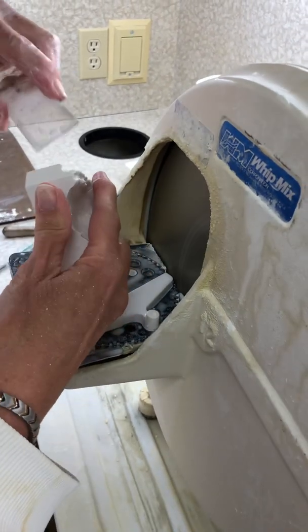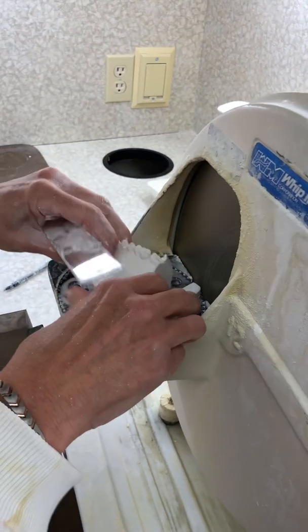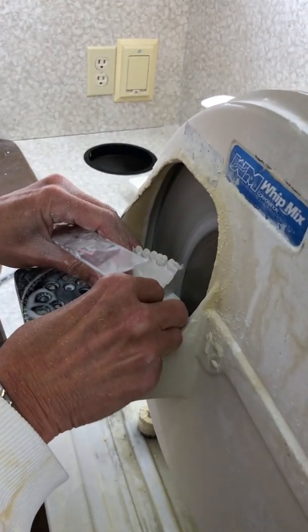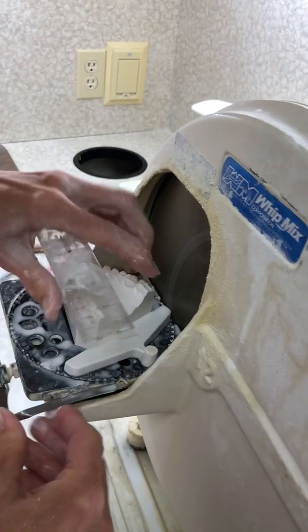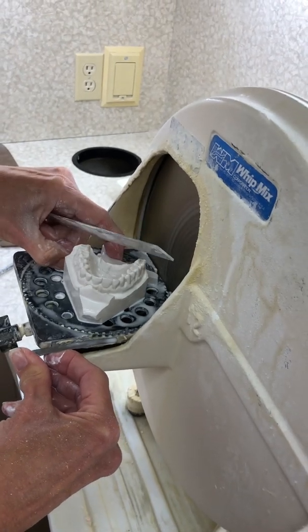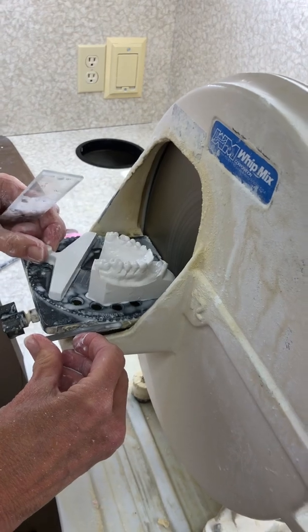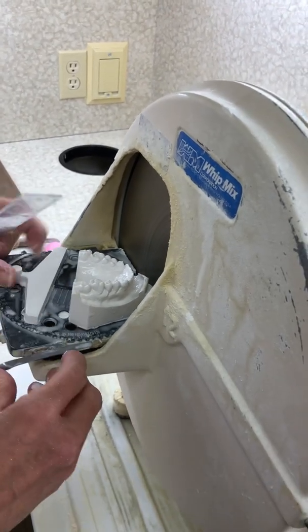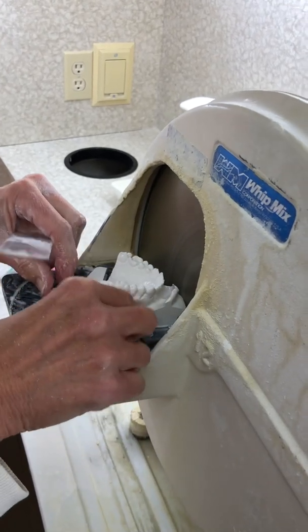And again, I'm just going to measure this to see what I've got to do. So this one's at 16. Not 16 and a half. So let's flip back and we'll just do a touch more on this side. Good. Now let's do 30. So we'll get it set up for 30. And we'll run in one side.